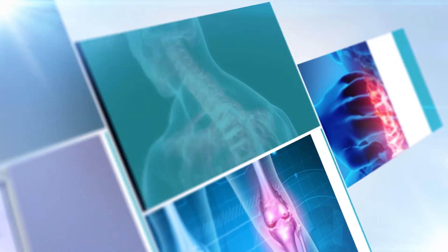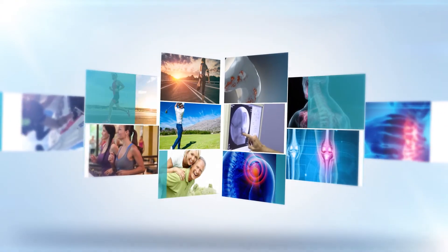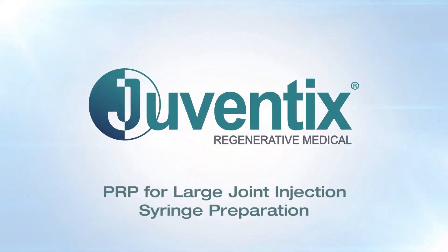Hello and thank you for choosing Juventix Regenerative Medical for your clinic's regenerative medicine needs. This video will demonstrate how to properly prepare a syringe of platelet-rich plasma to be used for a large joint injection.